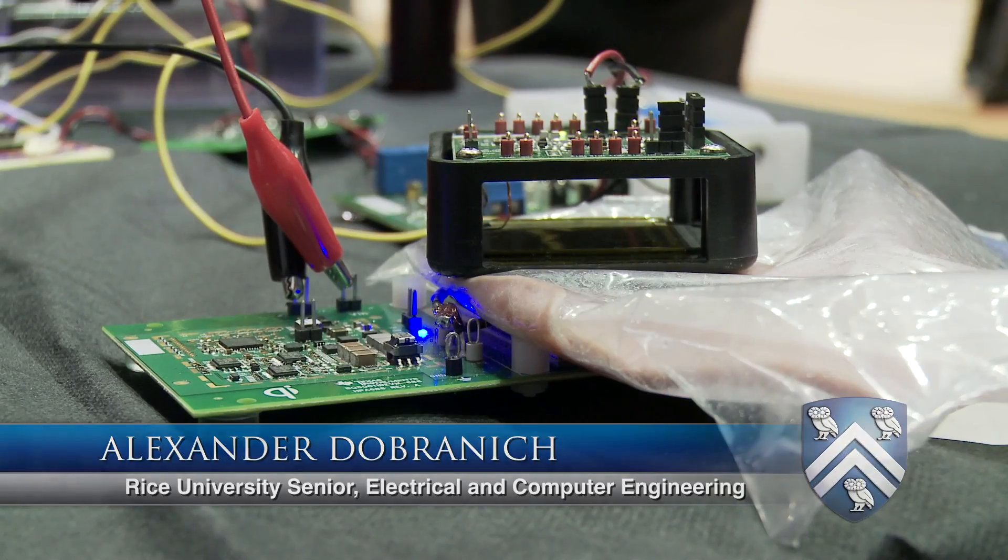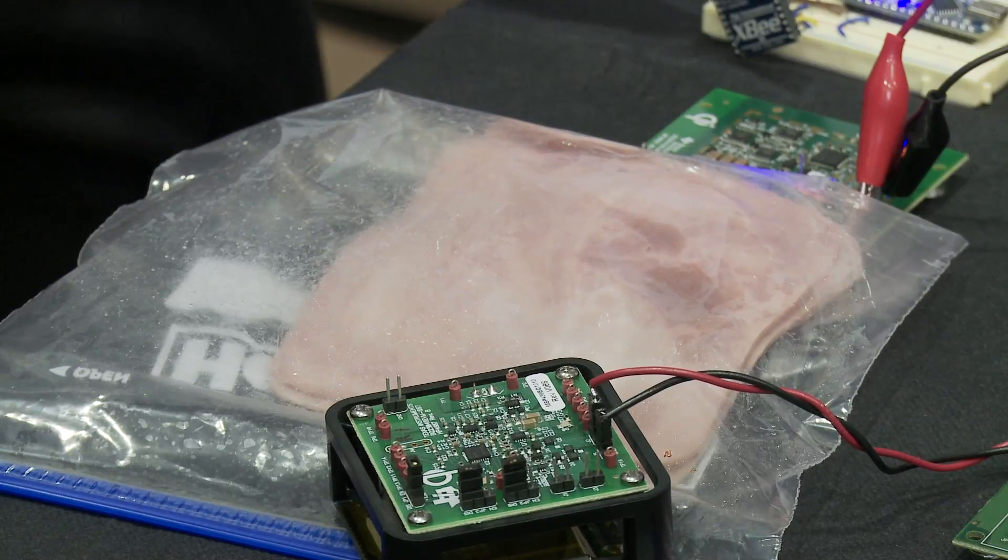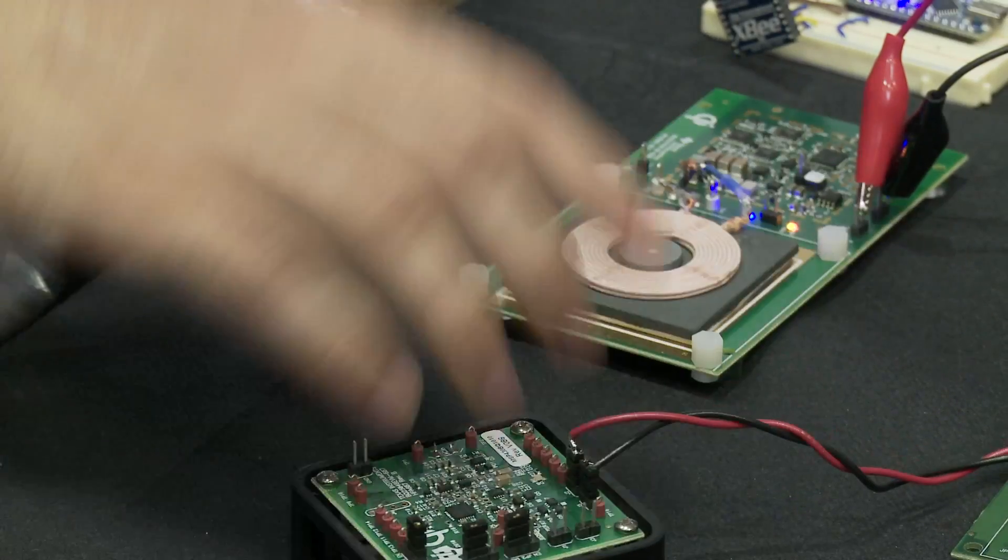That motor is being powered right now from an external power supply, but there are no actual wires between the external and the interior. We have an inductive coupling between two coils that is allowing this wireless power transfer.